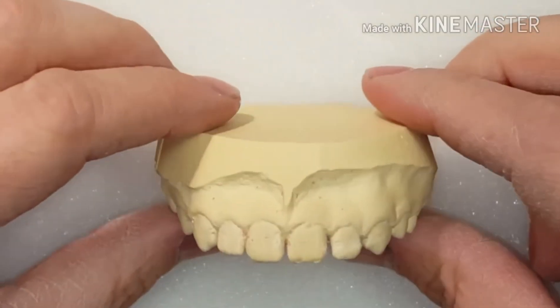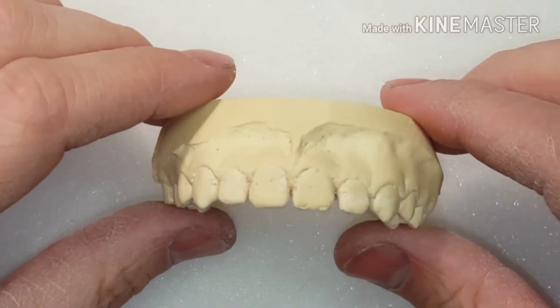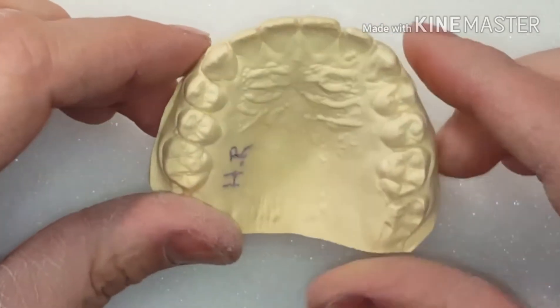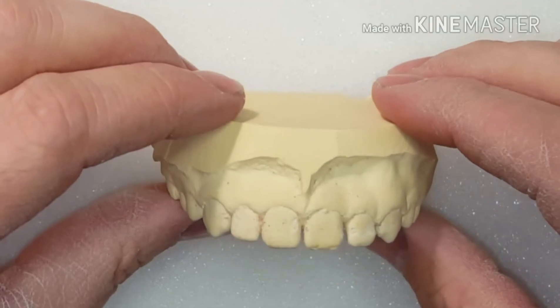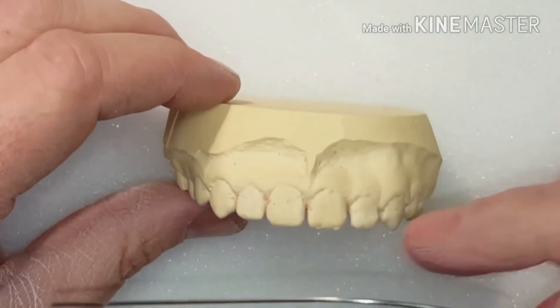The very first thing I do before I'm going to bend a wire — that I do on every single retainer, whatever type of appliance it is — is I make sure that my model is balanced. And what I mean by that is that it's equal to the plane of occlusion.